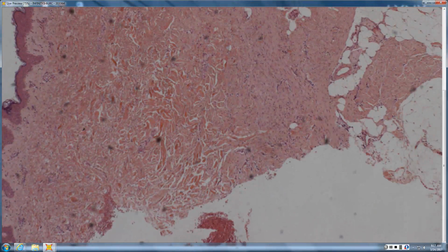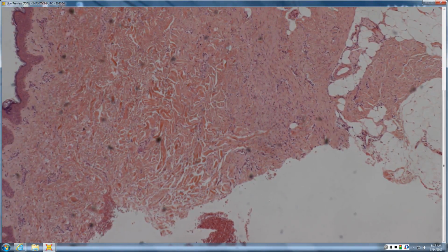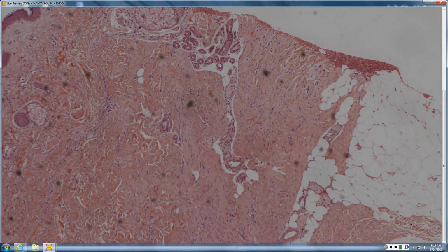I think this looks like a scar. Looks sort of like a scar. And why are you saying it looks like a scar? Well, you have the collagen fibers that are going sort of east-west. So it definitely has an east to west configuration like a scar. Now, does scar usually leave all your adnexal structures behind sitting pretty? No. But this thing respects the adnexal structures. So it's east-west like a scar, but it doesn't ablate the adnexal structures.